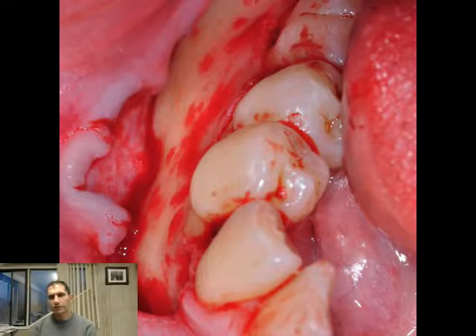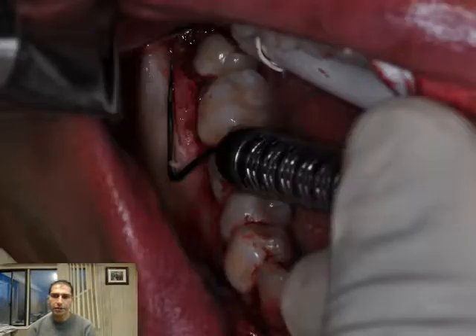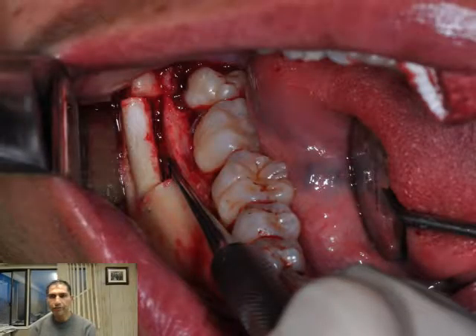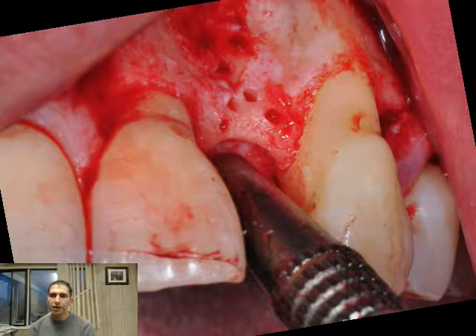I attempted this picture to show you the mental nerve bundle. We're going to measure here — this is the external oblique ridge of the patient. We're going to use piezo technology for atraumatic harvesting of the block.